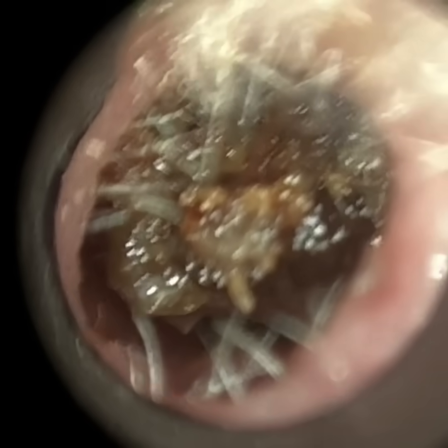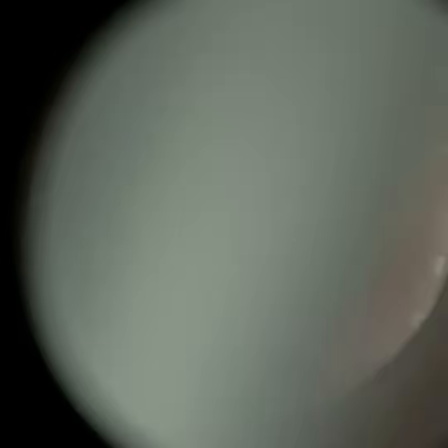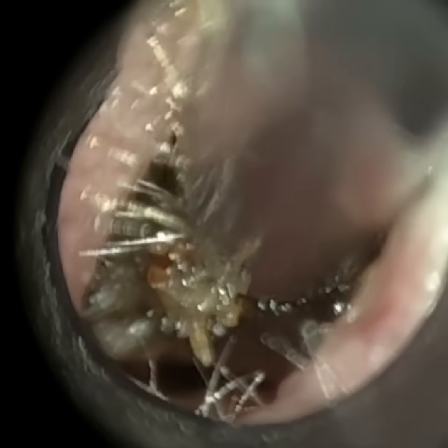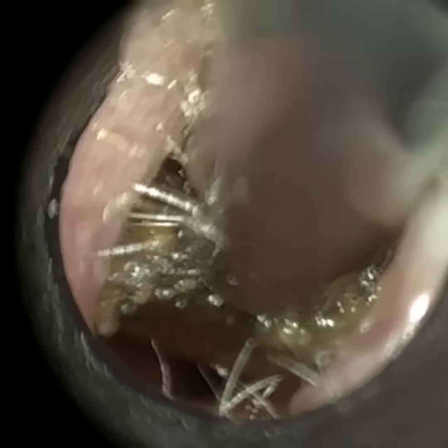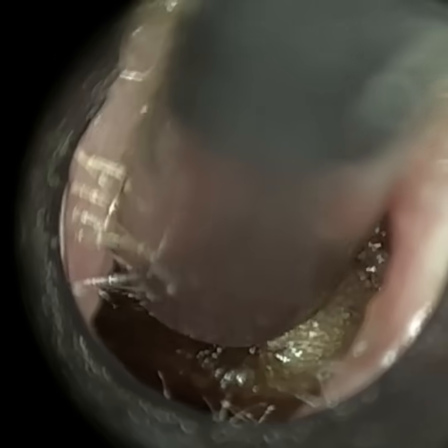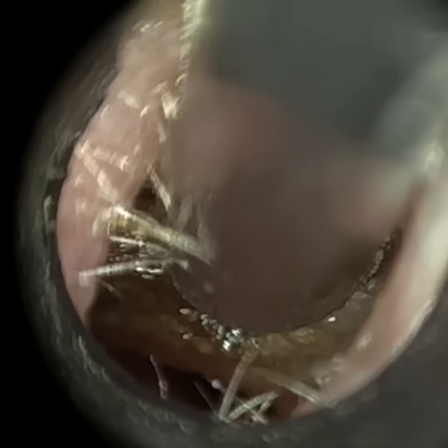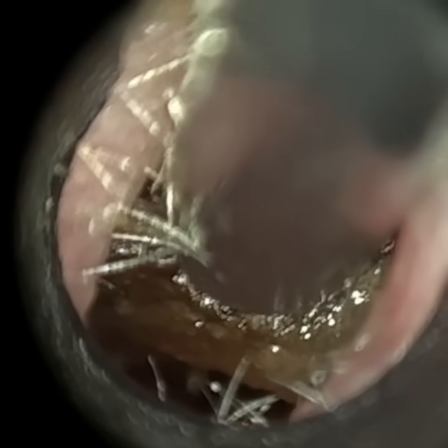There we are. I've just zoomed in a little bit more. I'm going to get it in focus. So whilst you're watching me suction this away, yes, going back to the tympanometry, we play sounds into the ear. So normally a low frequency sound. We change the pressure simultaneously, and we measure how much sound is reflected back out of the ear canal.